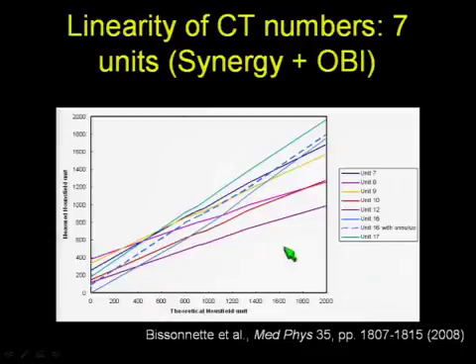CT calibration curves for a number of our units back home, and you can see right away that even though the curves are straight and linear, they don't superpose very well, and introducing or changing the scatter condition can in fact shift curves away from each other. So at this point, if people are interested in using CT numbers straight away from cone beam CT, I would advise them caution. The CT numbers are not stable and are dependent on the scatter condition.